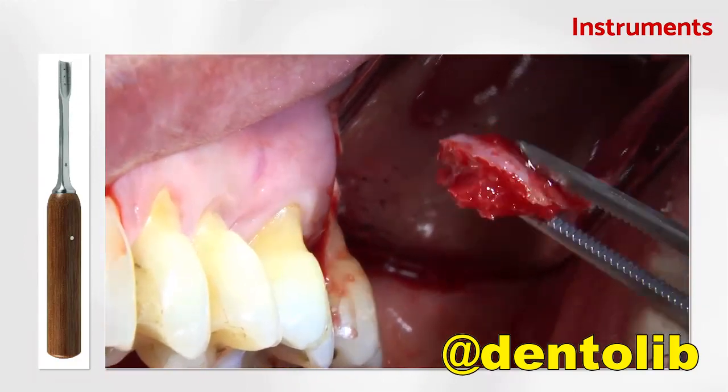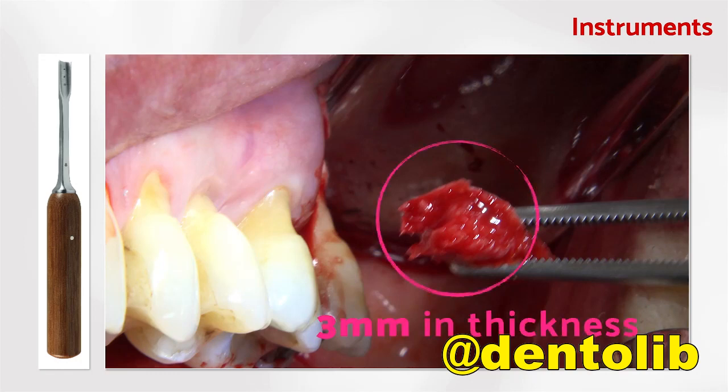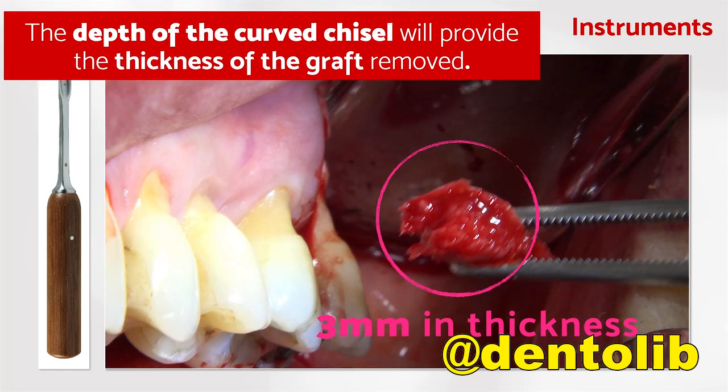And you can see here a corticocancellous block bone. Pay attention, not only the cortical layer, but also the marrow bone, the cancellous bone. And here you can see the 3 millimeters in thickness. This thickness will match exactly what we are looking for, the 3 millimeters of gap at the buccal aspect. So the depth of the curved chisel will provide the thickness of the graft removed.